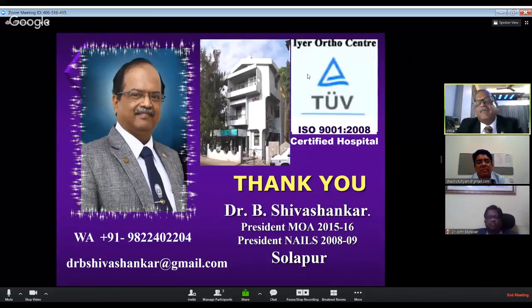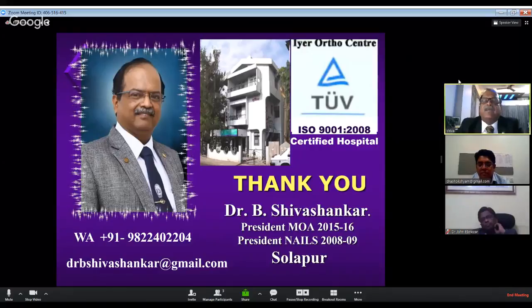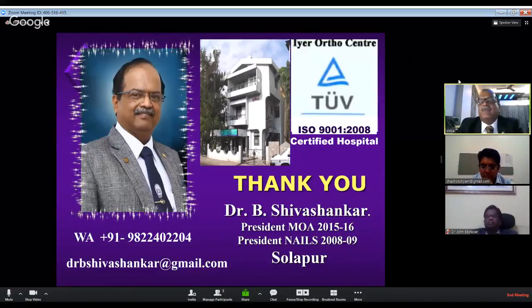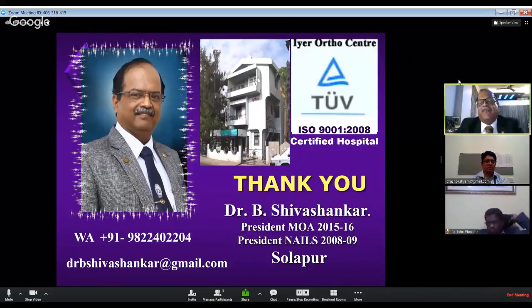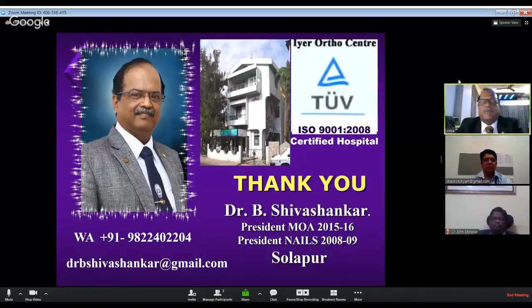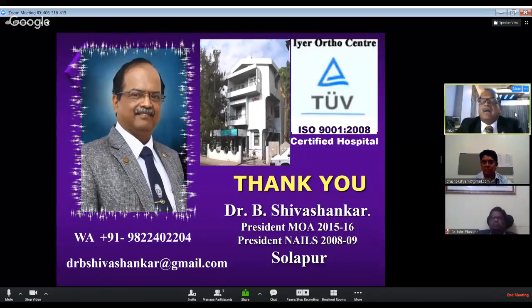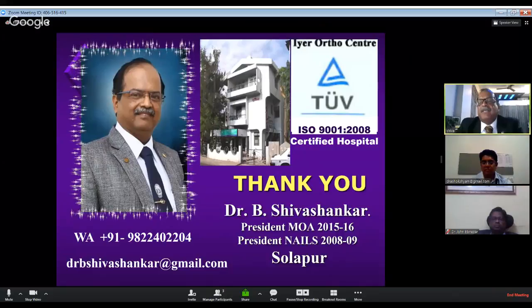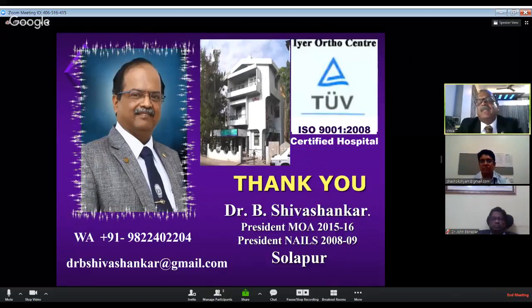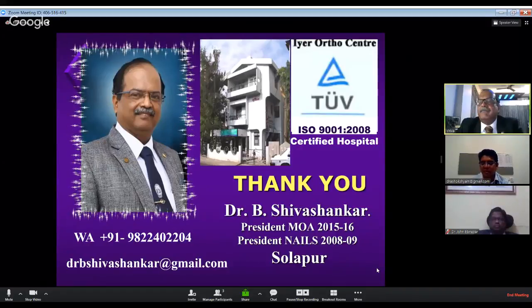Another option is wiring, which Shishul Babulkar and Sunil Kulkarni have come out with as a wiring technique. They use wiring for this. I think they are all little more additional things. You can do it if you are keen to get a 100% good looking X-ray. But if you are only concerned about the union and function, what I am saying is, push the screw inside, let the head of the screw touch the lateral part of the nail. That's more than sufficient.